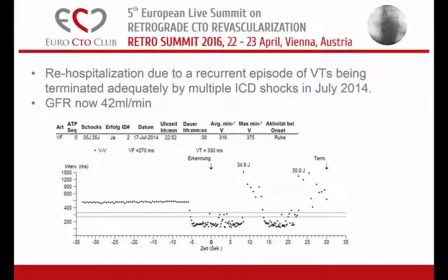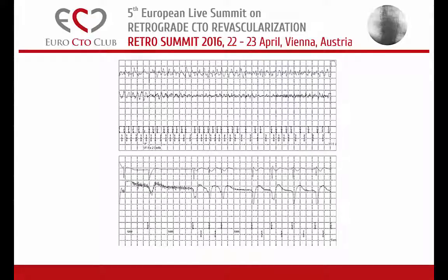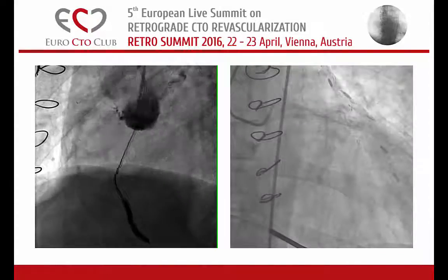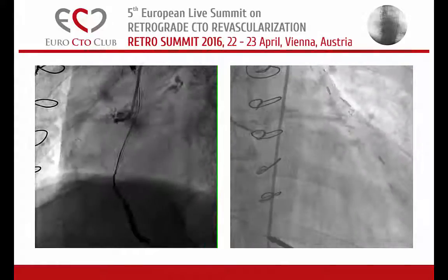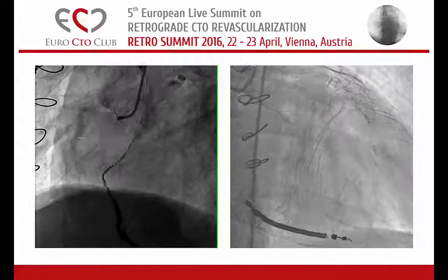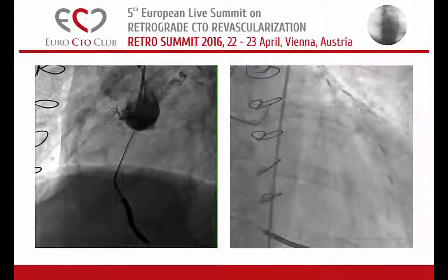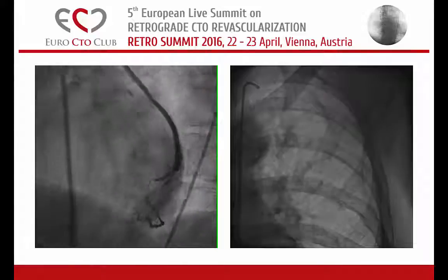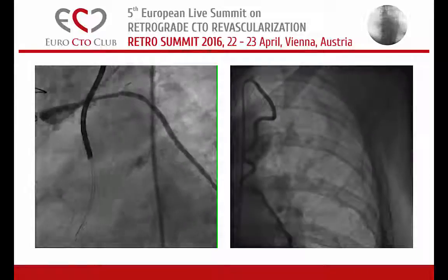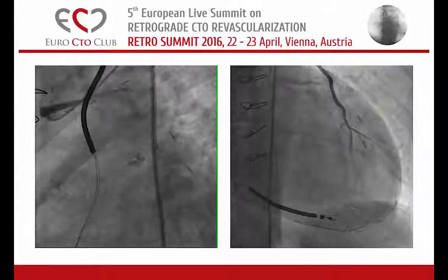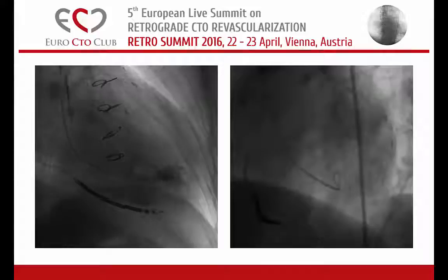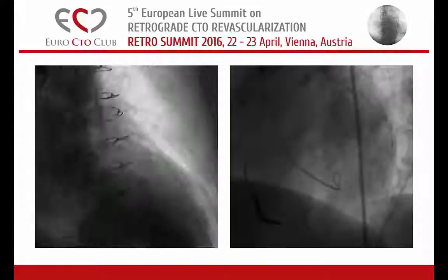In July 2014, he was re-hospitalized during a recurrent episode of ventricular tachycardia, and that was the first time they showed me the patient. He was in Austria and had a GFR of 42. They showed me the angio and asked if I could help. This is the situation where we have a really very calcified RCA and you can see from the left side beautiful collaterals to the PDA branch. Here is the vein graft to the lateral wall and here is the LIMA graft to the LAD, which is patent.